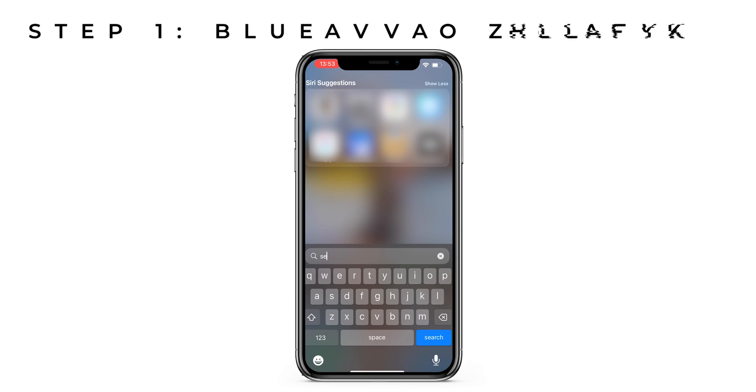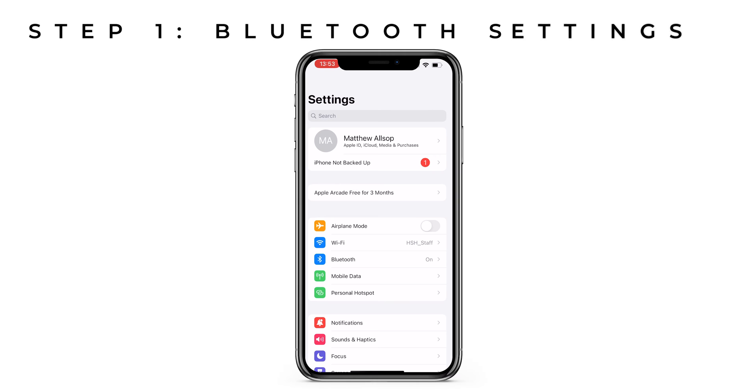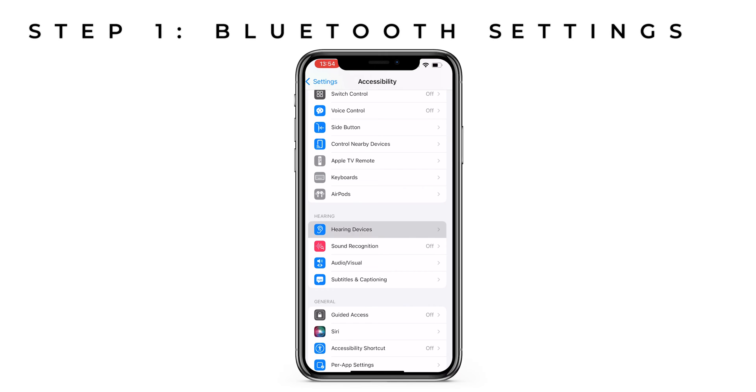Pulling up my screen in front of me, let's get you started. First of all, find the Settings app on your iPhone, then scroll down to the Accessibility menu. From here, scroll down to Hearing Devices.